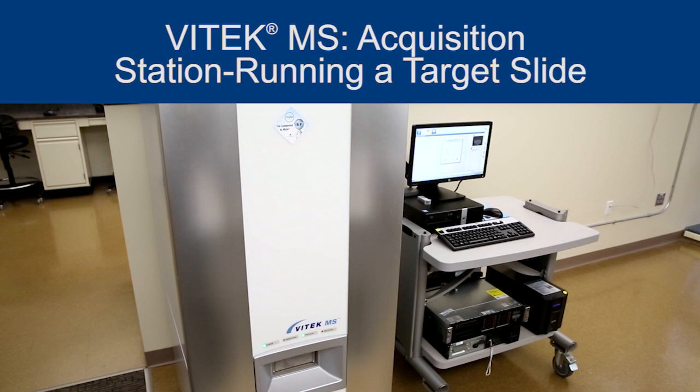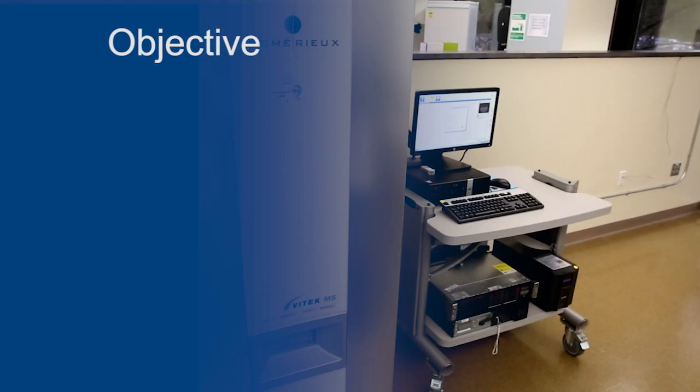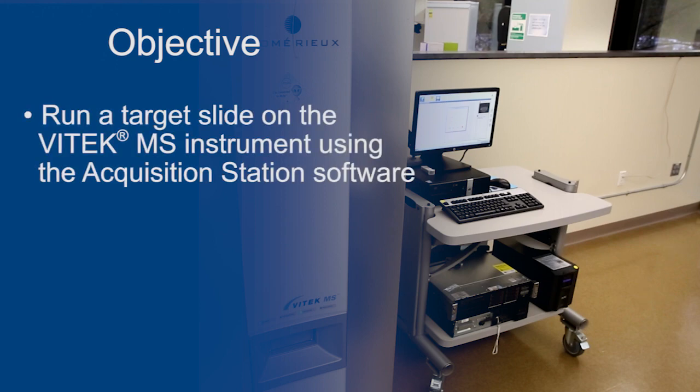This video explains how to use the Acquisition Station software to run a VITEK MSDS target slide on the VITEK MS instrument. At the end of this video, you should be able to run a target slide on the VITEK MS instrument using the Acquisition Station software.